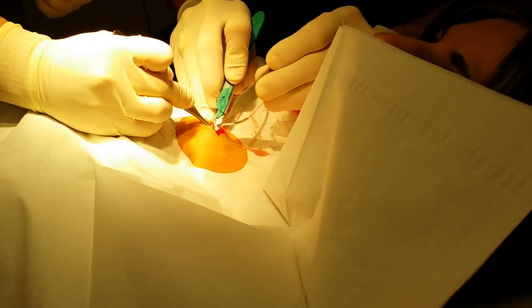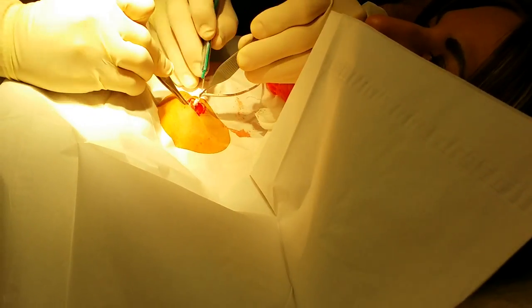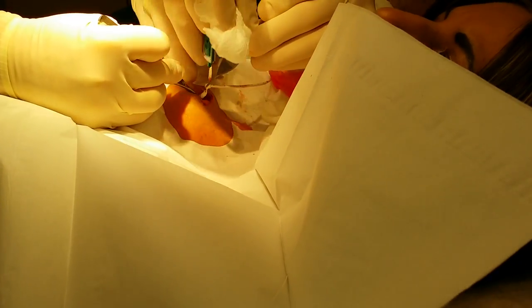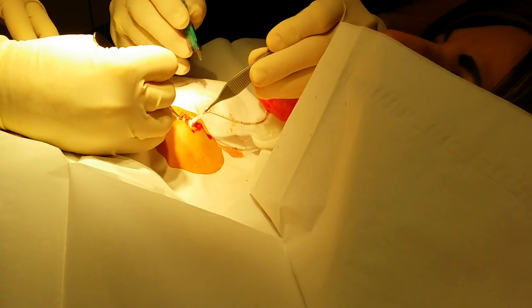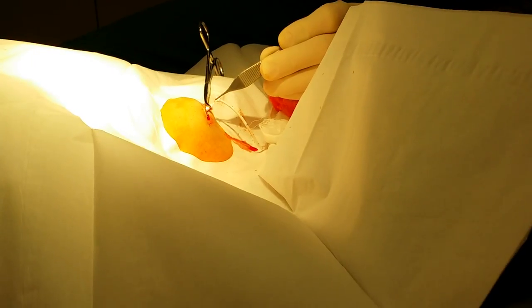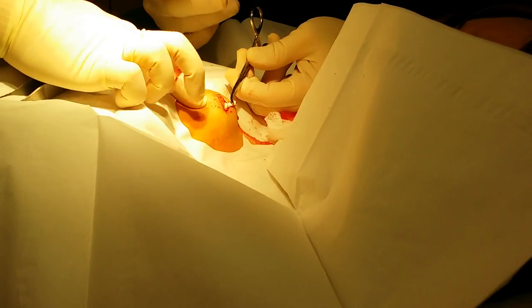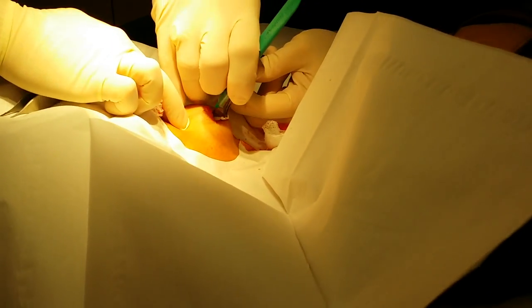This usually requires a knife again, so I go under it and kind of saw it off from everything connected underneath. Your surgeon probably put a stitch in — I cut any stitch and then cut through any capsule holding it in place. We're starting to see it — it's like giving birth here! No it's not — I don't think you've given birth, but your skin's about to give birth here.